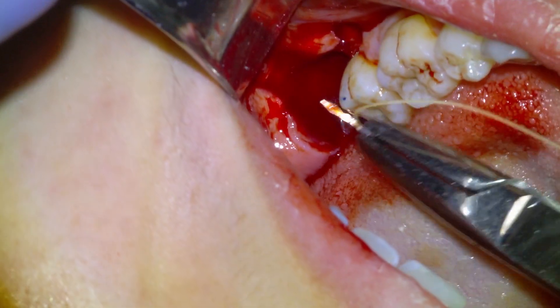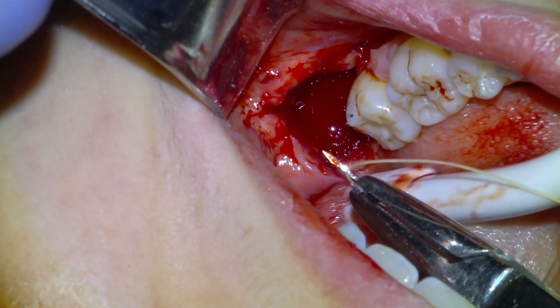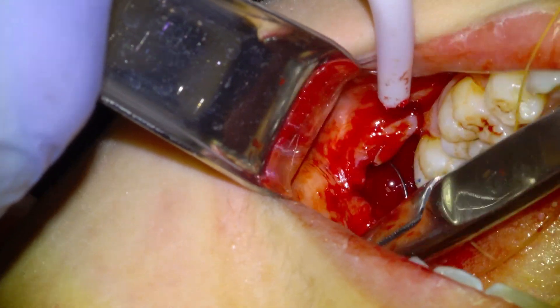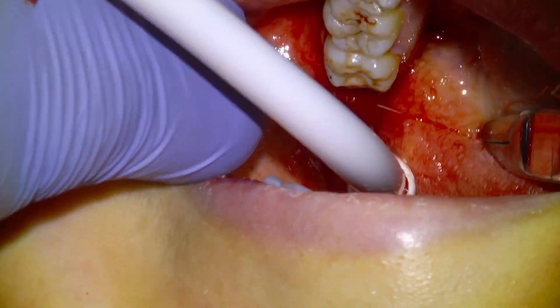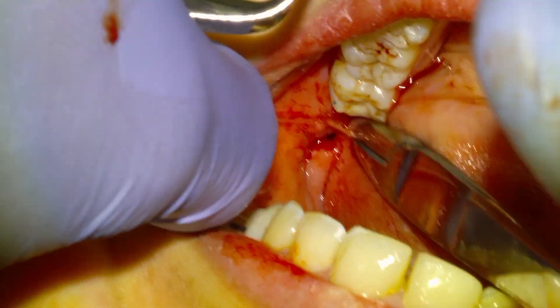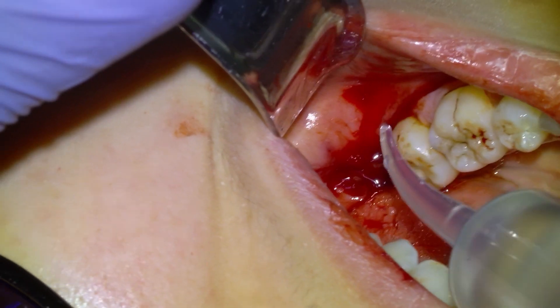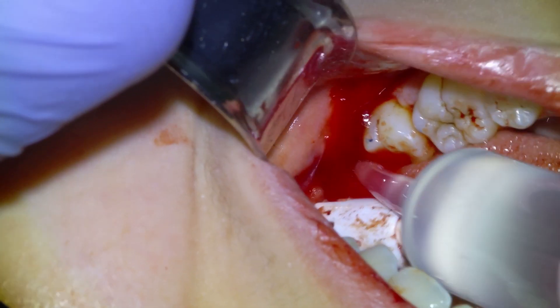I'll suture about half the cases of surgical wisdom tooth extractions — I don't think it's absolutely necessary every time, but we did in this case. We're going to use 5-0 chromic gut, which is resorbable, and tell the patient the suture is going to disintegrate in a couple of days. We'll do three throws, cut the suture, and give a thorough irrigation with sterile saline.